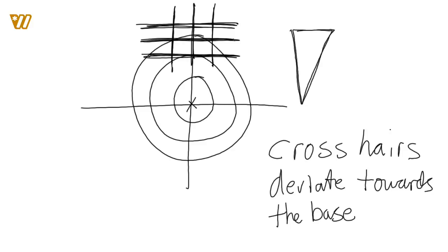Here our crosshairs have been deviated superiorly. That means that we have base up prism. If our crosshairs are moved down here inferiorly, that means we're going to have base down prism. I think that's hopefully an easy way to go through those examples and understand that. I think it'll help unlock that concept, which, to be honest with you, is kind of a difficult concept that I've seen working with students throughout the years. Like I said, the take-home message is your crosshairs deviate towards the base.